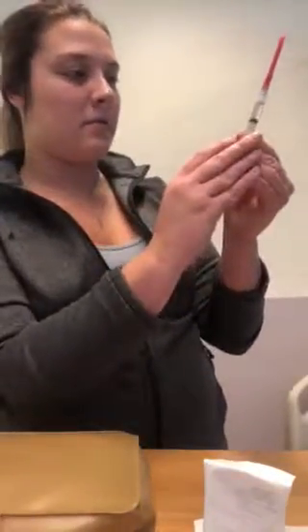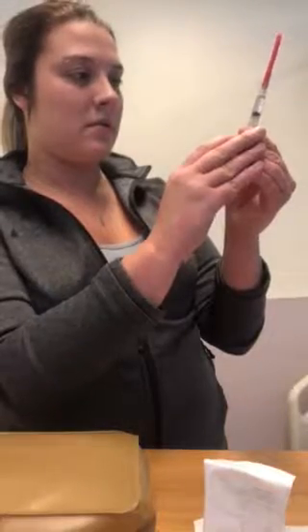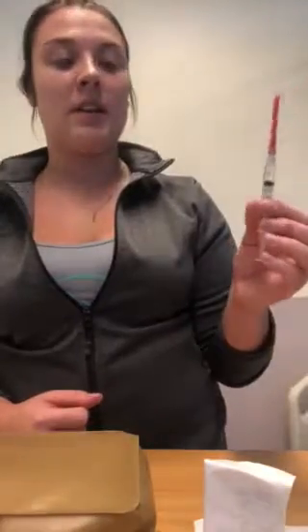And then I also would have done the scoop method, so I don't have my needle sticking out. Okay, so I have nicely my 1 milliliter of morphine.